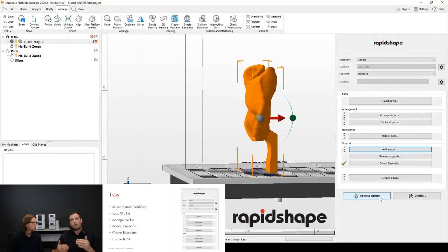Well, when you want proper, predictable supports to be created, we have determined that 3 mm is sufficient distance for a minimum support size to have reliable supports come from it. And that's why we have that 3 mm. Yes. Arrays. Yeah. I just saw the next question. We already answered pretty much.